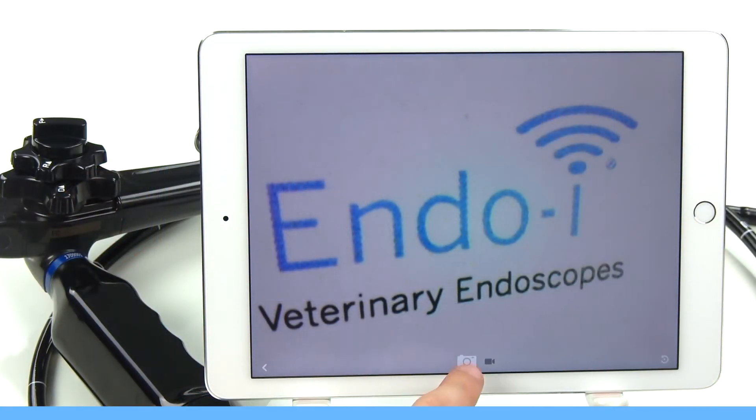Now back to the app. Once you have a live image, simply click at the bottom of the screen to choose either photo or video capture. And you're all set to start documenting your endoscopic procedures.